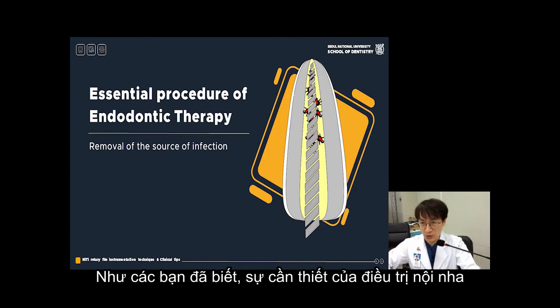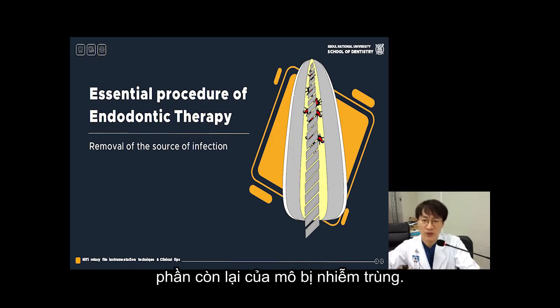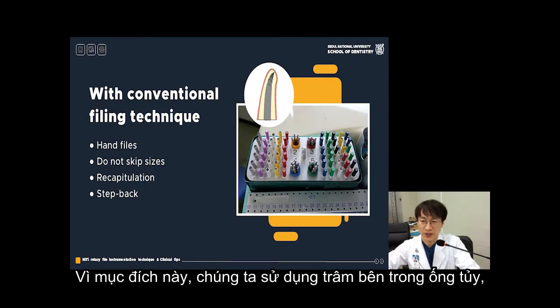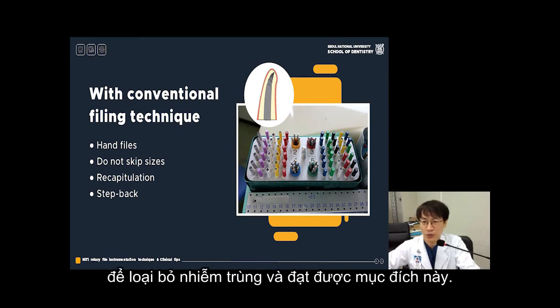So as you already know, the essential of root canal therapy is to remove the source of infection from inside of the root canal. It may be infection or the remnants of the infected tissue. So for this purpose, we use files inside the root canal. And the hand file has been used for decades or centuries to get rid of the infection and to achieve this purpose.